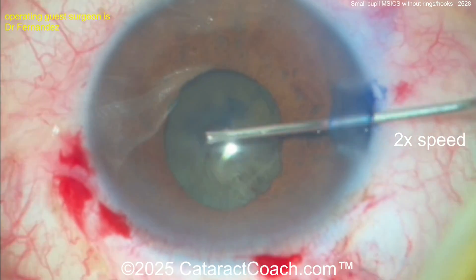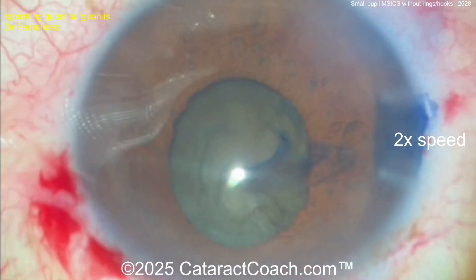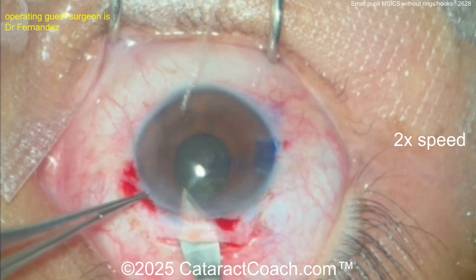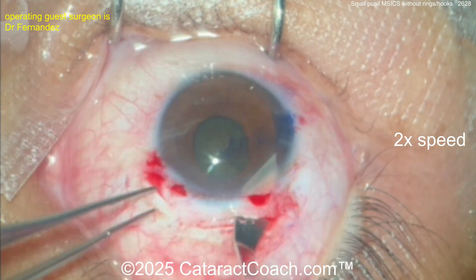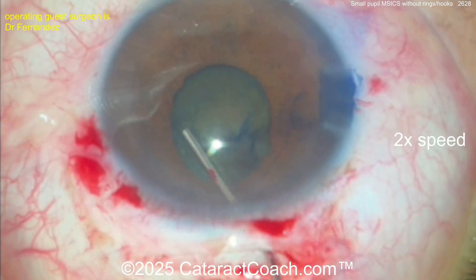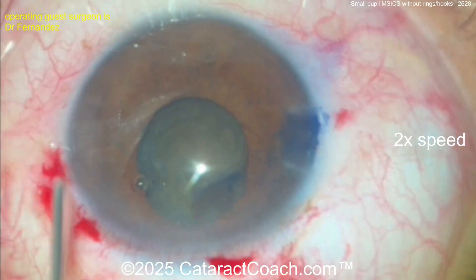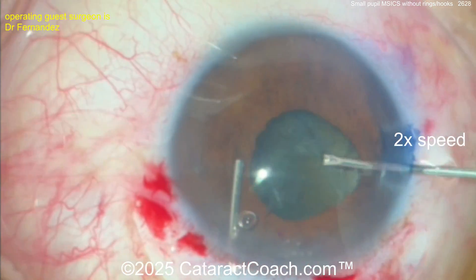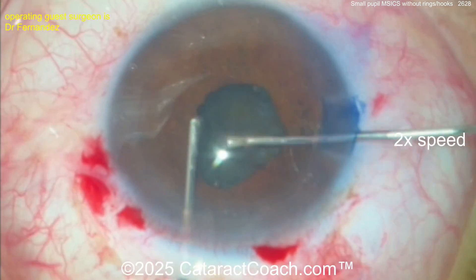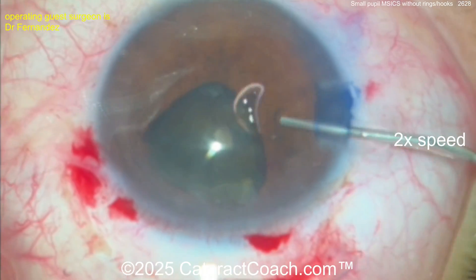Now zooming in and getting a nice five millimeter capsular rhexis — don't make a baby rhexis here. In this case you're going to make the rhexis bigger than the pupil, and that's nicely done. You have to get the nucleus out of the bag, so now entering the AC through the main incision, widening that up. A little gentle hydrodissection — you want to get this nucleus out of the bag. Take your time; the nucleus needs to come out of the bag.